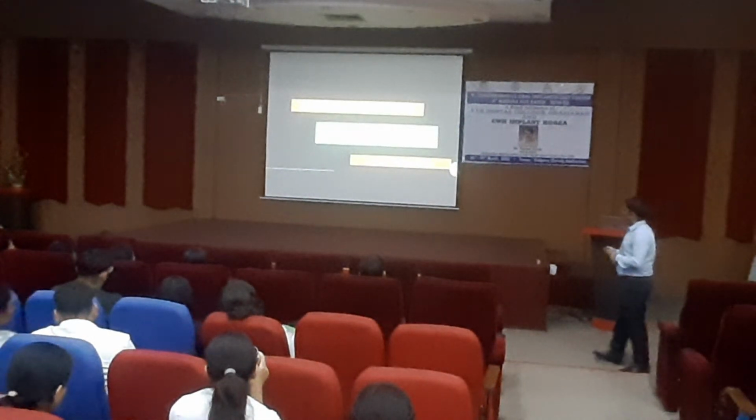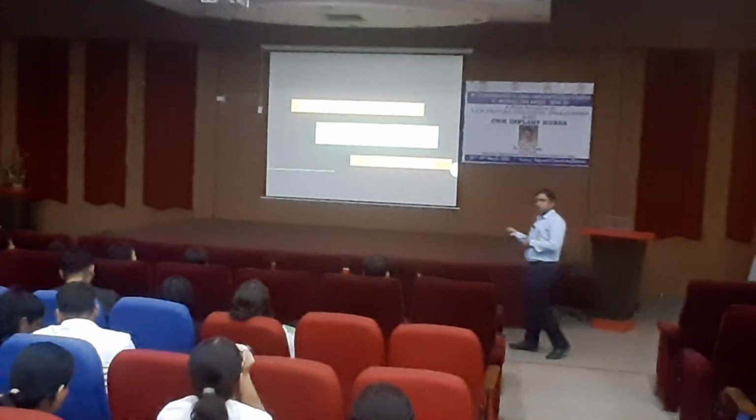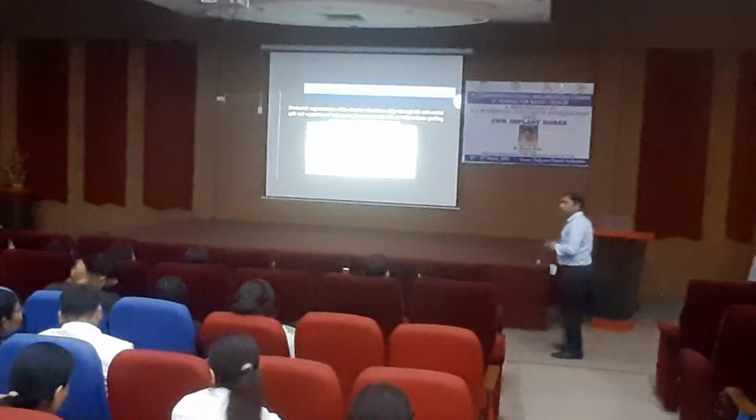Now we come to the graftless procedure. Only we are talking about 3: the ridge split, osteodensification, which I think Dr. Raul already discussed, and tilted implant. So ridge split to gain the horizontal width.